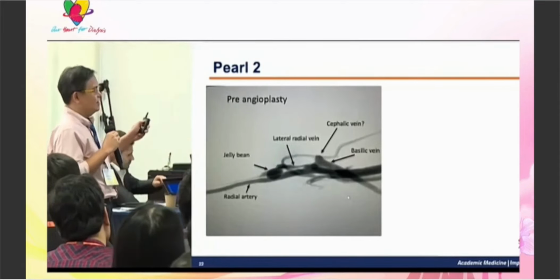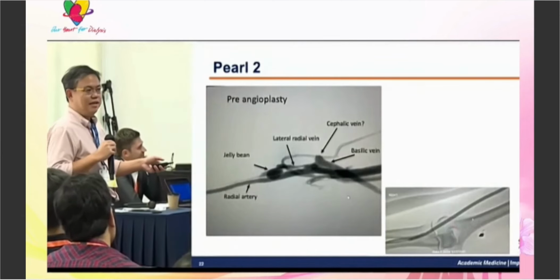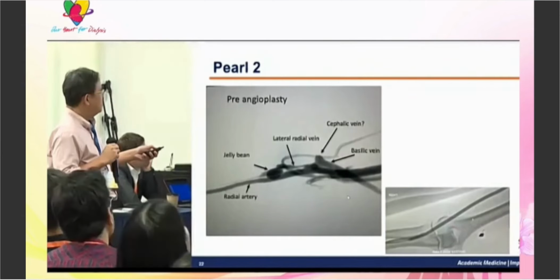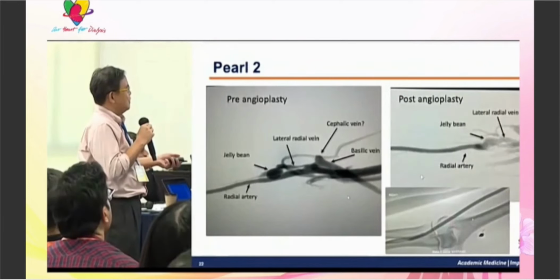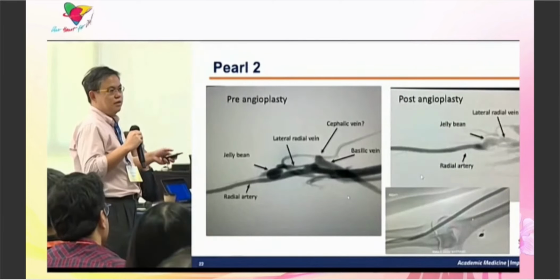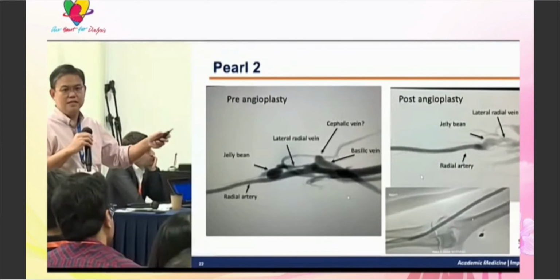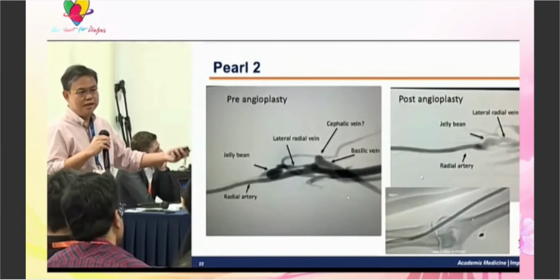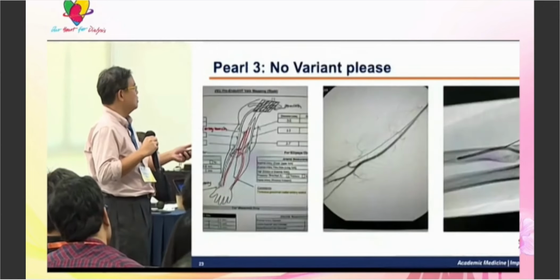Okay, 2 minutes more. I will show this. Okay, and then what you need to do, you have to come back in again, open up the channel, using a Mustang in this case. And then finally, you get a nice big cephalic vein for the nurses to actually cannulate. Again, these are cases where, if you choose borderline cases, you must be prepared to come back in to salvage it. That's the conclusion at the end of the day. And that means an additional procedure for the patient.